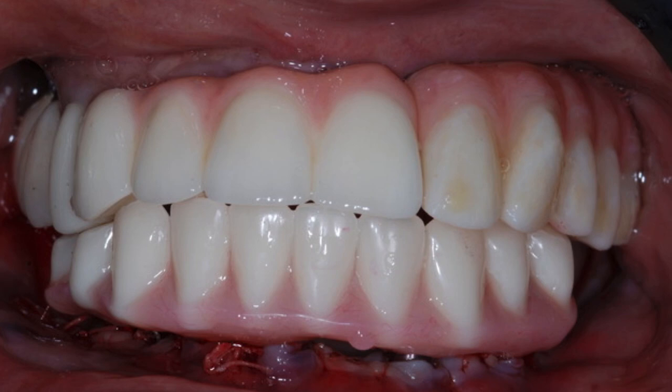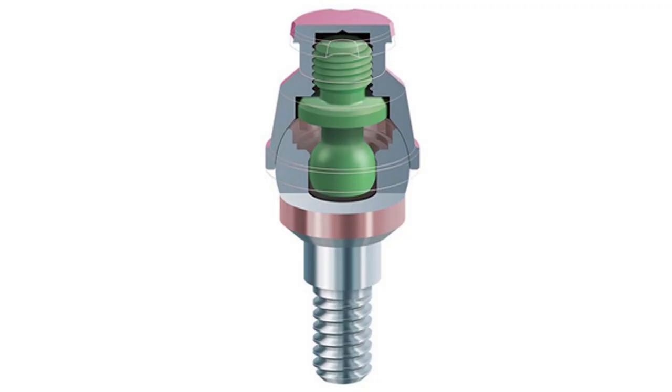And that's just one more final picture. Yes. I know she's got some upper stuff going on there that you're working with. So I just wanted to take a look and let the viewers see this. This last shot is kind of a cutaway of the FTX abutment with the retention ball in the denture housing cap. And so you can see it screws into that cap and there's a little hex on the other side to get it in and out.